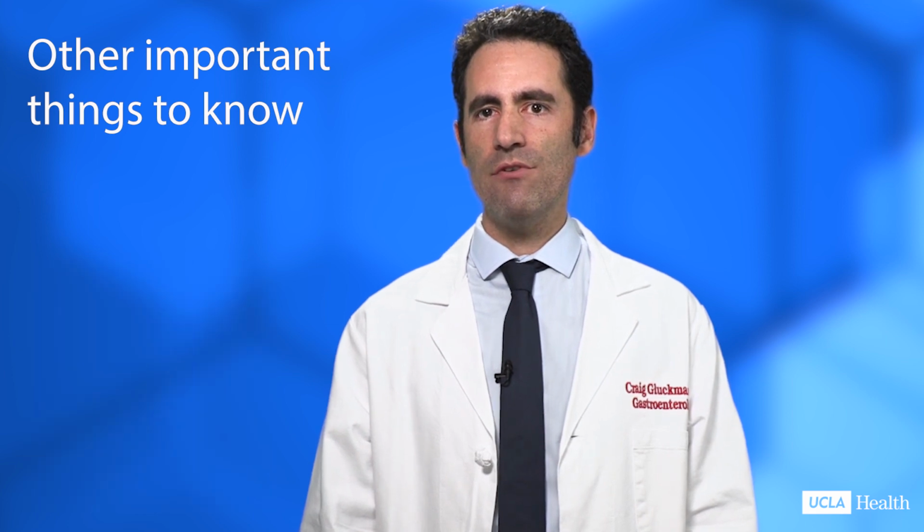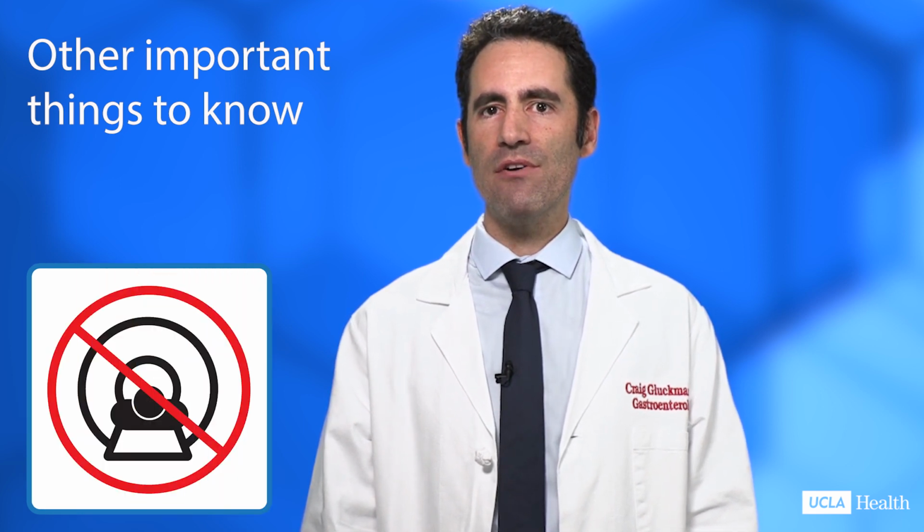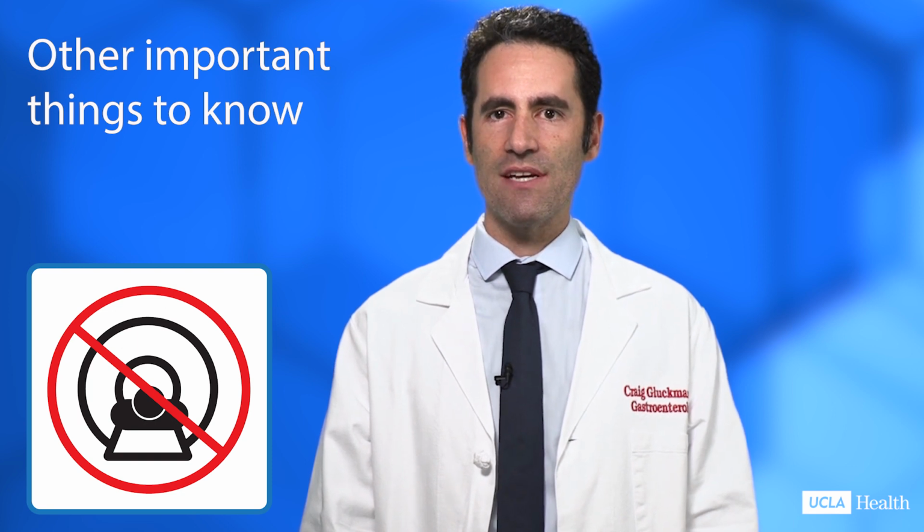You'll also want to wear the recorder while you sleep or keep it within 3 feet of you. The recorder does need to stay dry, so please remove it before taking a shower. And finally, do not have an MRI for 30 days after the placement of the Bravo capsule in your esophagus.